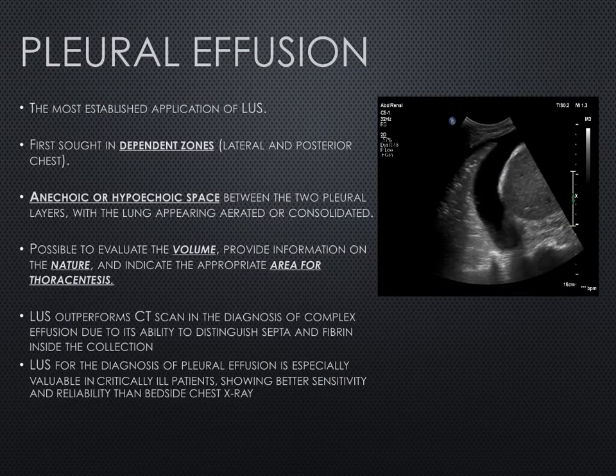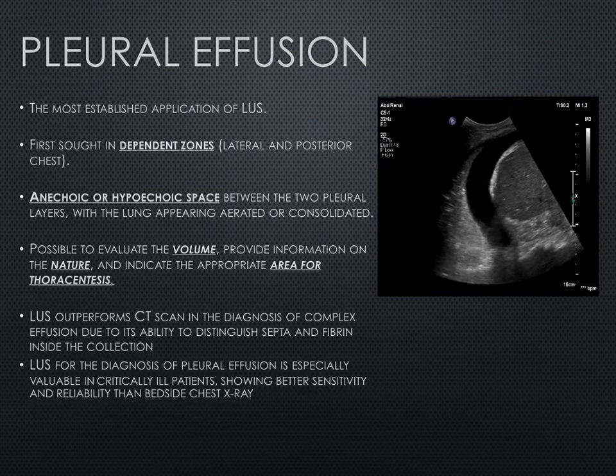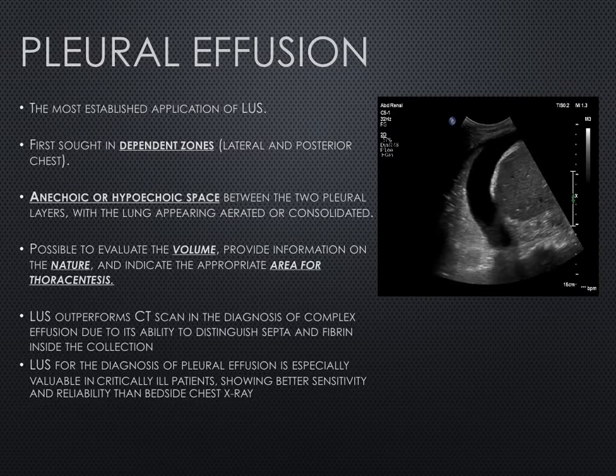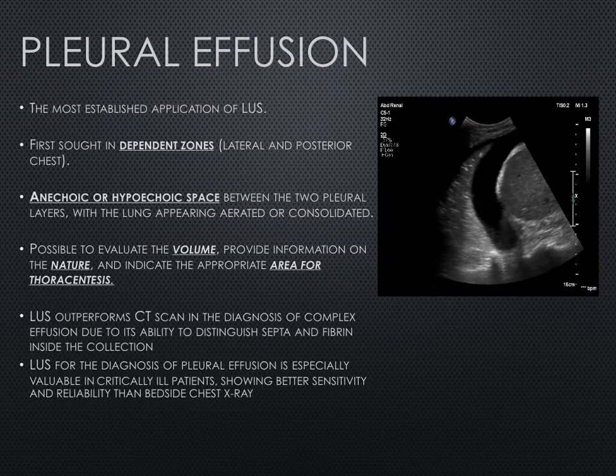So in regards to lung ultrasound, identification and monitoring of pleural effusions is probably one of the most established applications of the use of lung ultrasound across all of the areas where it's used.